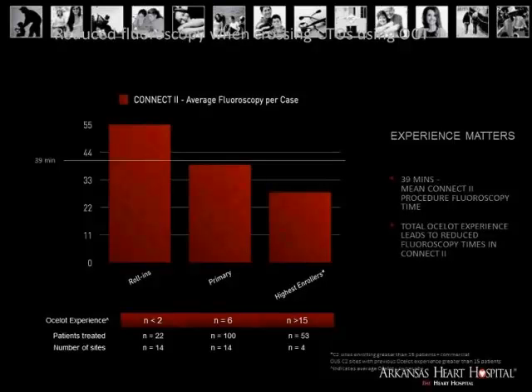and the more you will be able to stay off the fluoro pedal. A lot of times we've noticed that we're stepping on the fluoro pedal without even paying attention to the fluoroscopy and just paying attention to the OCT image.